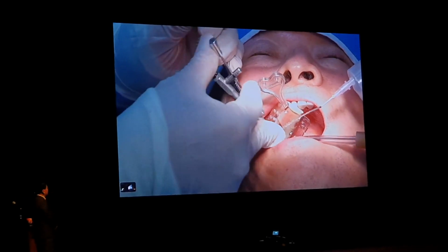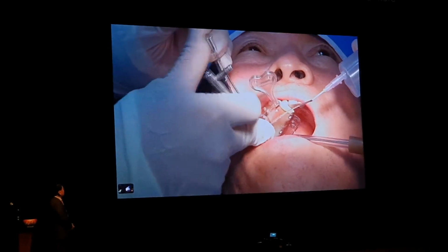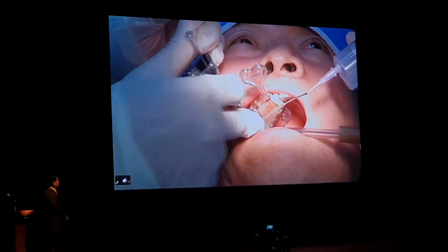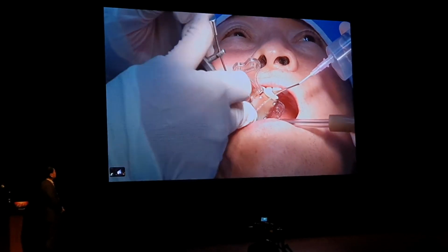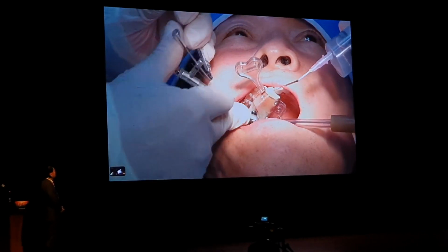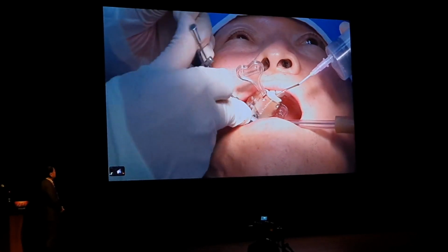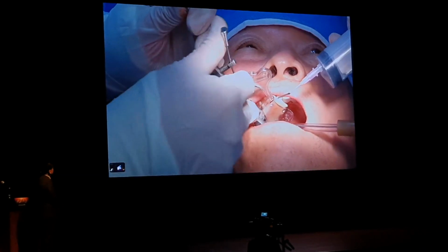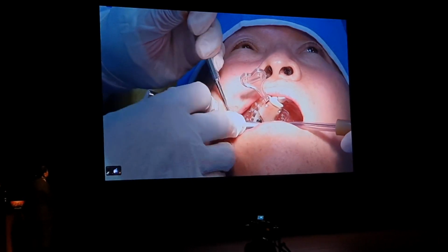About 30 to 40 Newton centimeter. Unbelievable. He pointed out the difference. So they will keep trying to insert the IT type, and he sensed the error. And now the correct one is being inserted. So how's the initial stability? Very good, very stable. Friction with the guide may affect the stability, so the actual initial stability could be a little less. I'll measure the value once again without the guide in place.